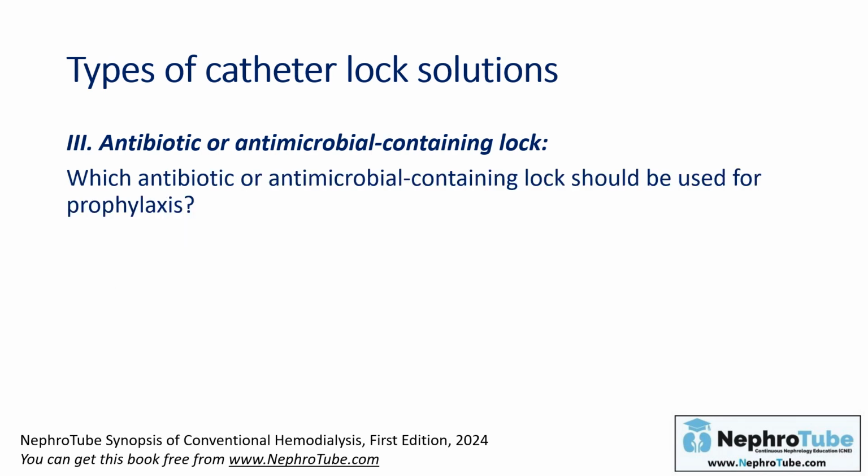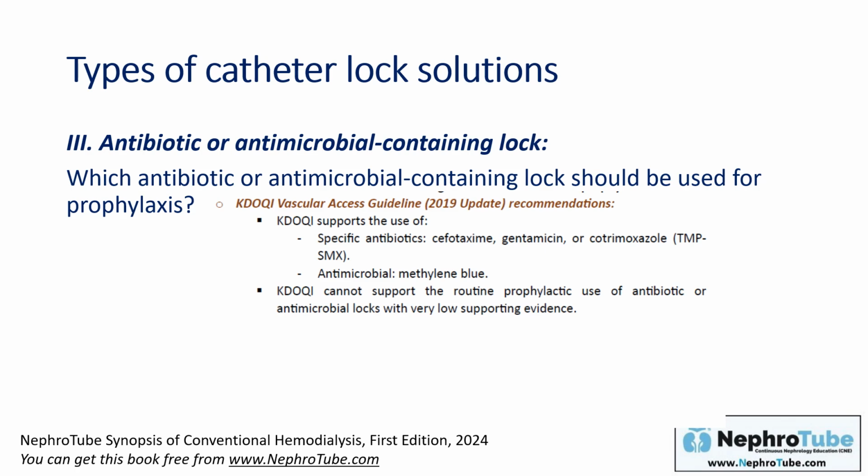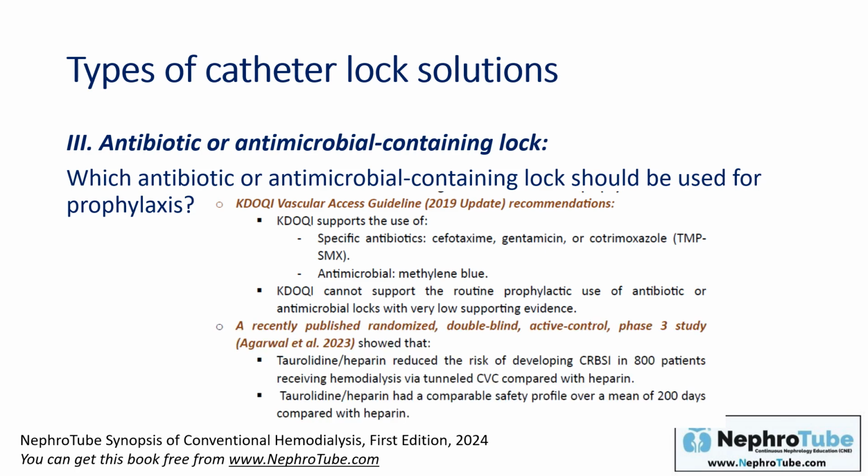The question, which antibiotic or antimicrobial agent can be used for catheter lock? Regarding the KDOQI Vascular Access Guideline 2019 update, they support the use of specific antibiotics: cefotaxime, gentamicin, or cotrimoxazole. And regarding antimicrobials, they supported the use of methylene blue. And they mentioned that they cannot support antimicrobials and antibiotics with very low evidence.